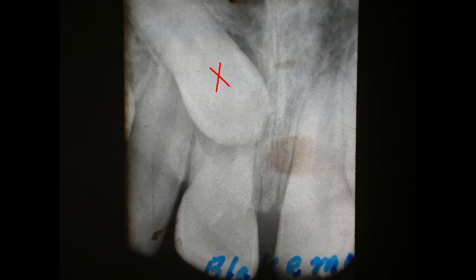All right, here's a much better picture, just an individual x-ray we took of that. And here you can see the outline of the lateral up above here. So it didn't just cut the lateral completely off. The lateral is kind of laying down here, but part of it is eaten away. And the cuspid just came in right on top of the central and ate every bit of the central. I see no evidence of that central tooth up above or under the tooth in any way.